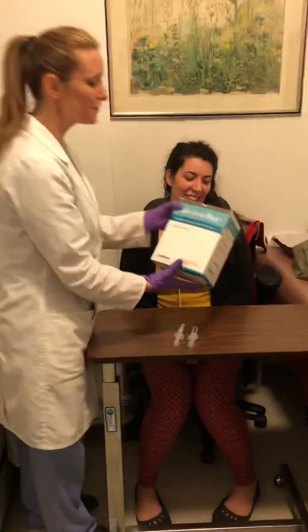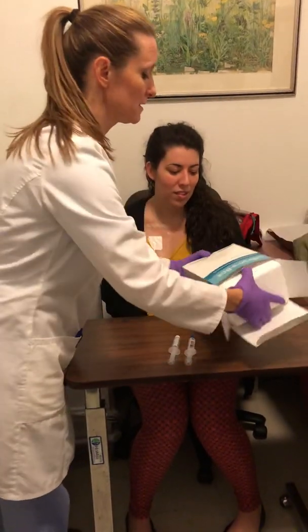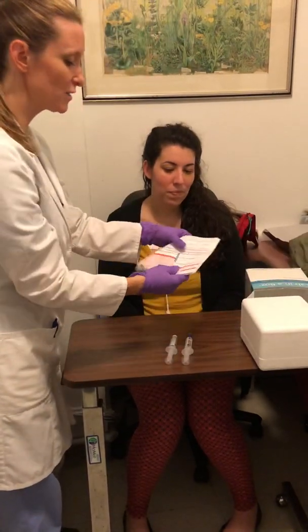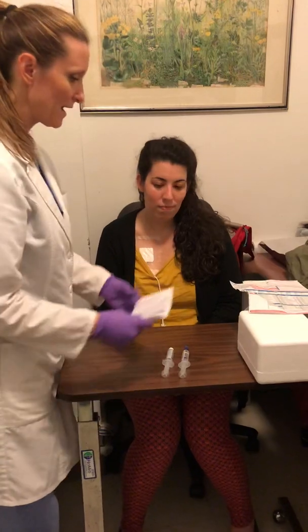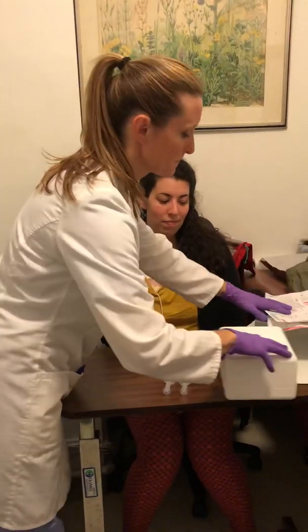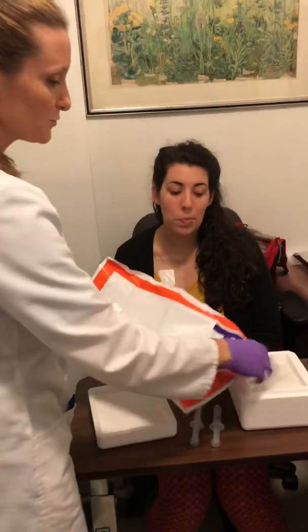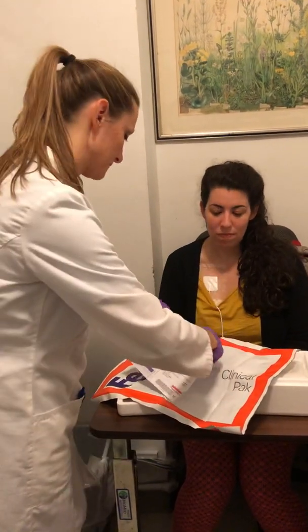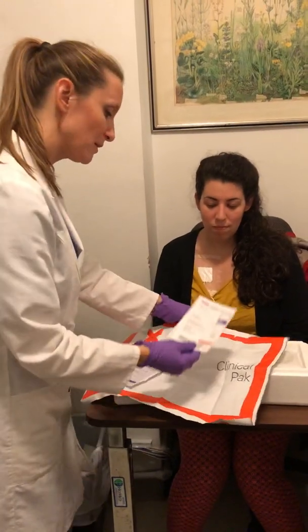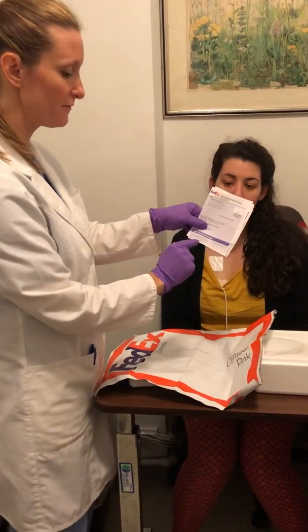Today we're going to use a lab-in-a-box that you can use right in the patient's home to draw blood. In the box we have the requisition — you should have an order from the physician for what blood he needs — and we have the FedEx shipping label. Once we're done drawing, everything will be packed up back in the box and in the FedEx. After you fill out your form, the billable stamp is filled out and put right into the center, then you call the number on the bottom: 1-800-GO-FEDEX.